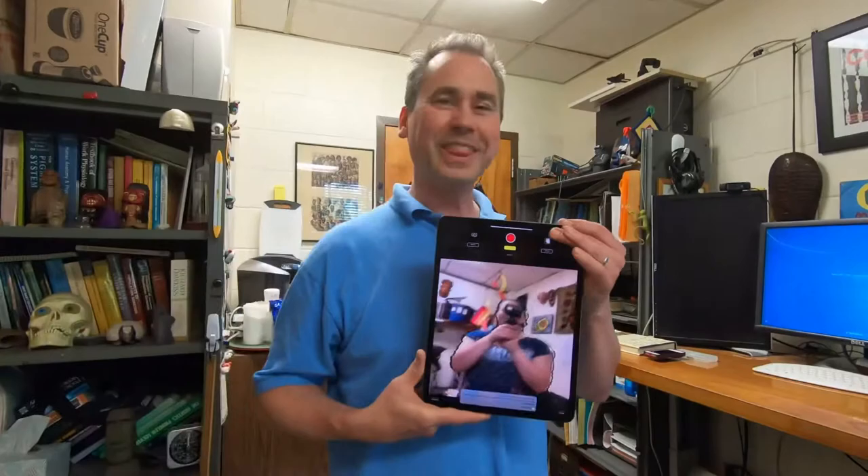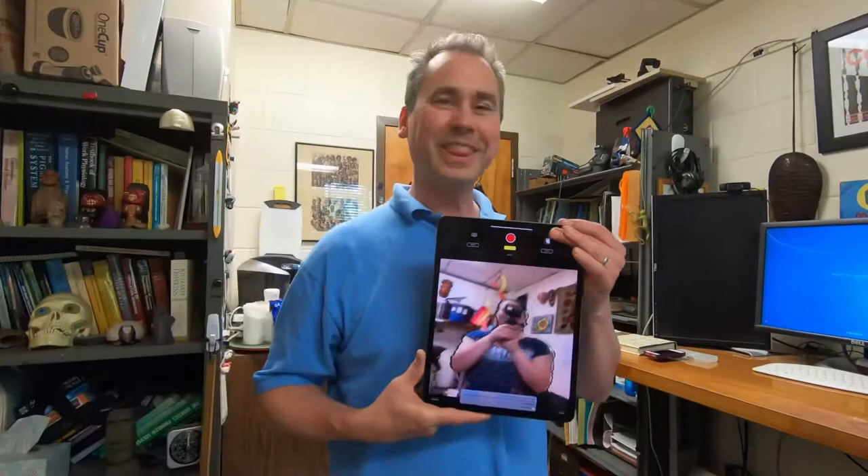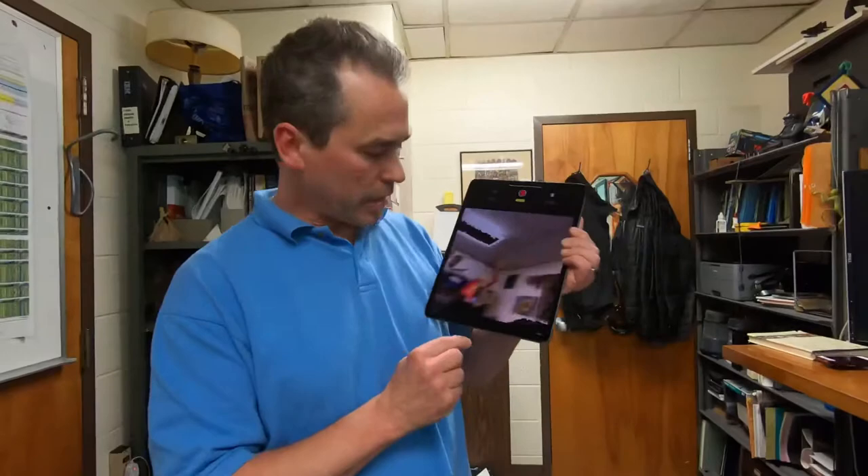So the TrueDepth cameras are here on the bottom — or what's usually the top of the iPad — but we're finding it's better to image by flipping the iPad over and having the cameras on the bottom.